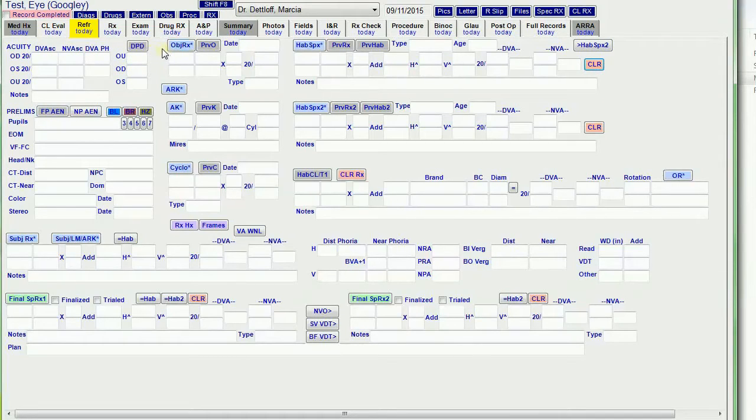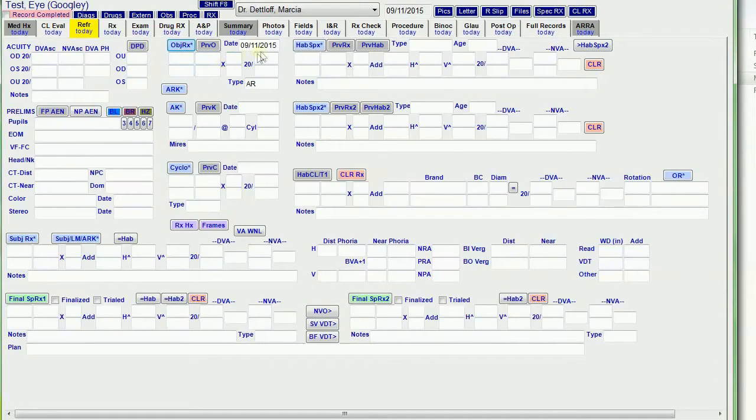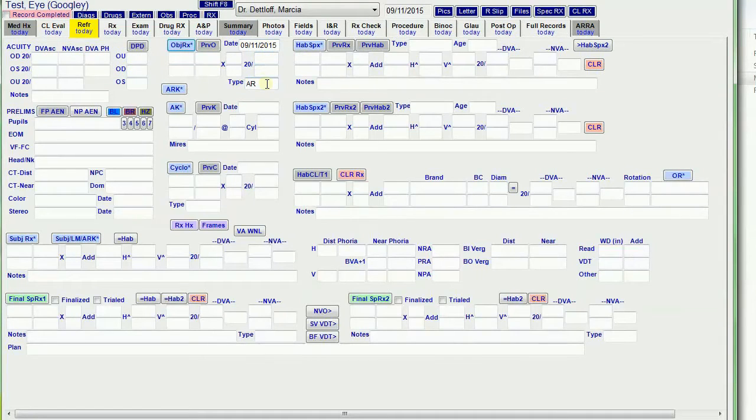I've got the objective RX. It's not going to bring anything over because it's not hooked up, but when I click that button it brings the data into the AR fields and it puts the date and indicates that it's AR.